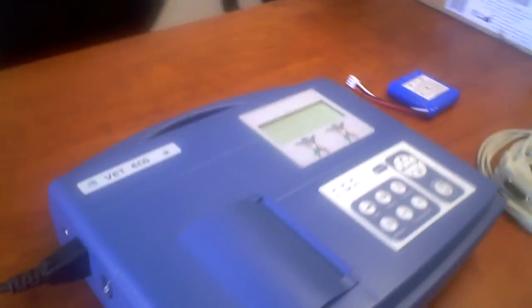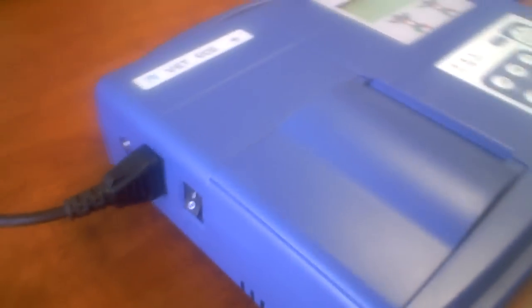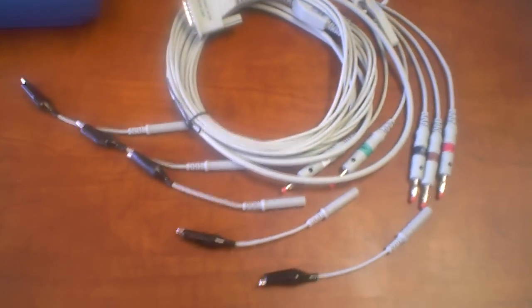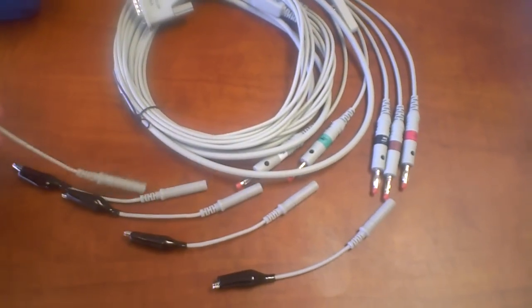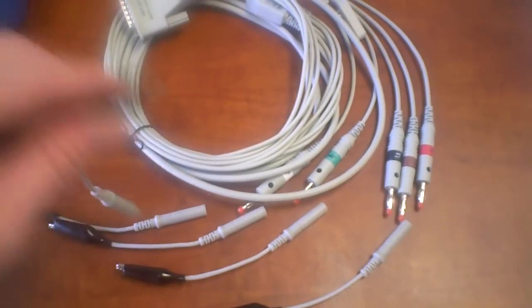Over on this side, you have the power. This is where your thermal paper will be going in. The lead cables are all set up with alligator mouth hookups, which is where the electrodes are going to connect.